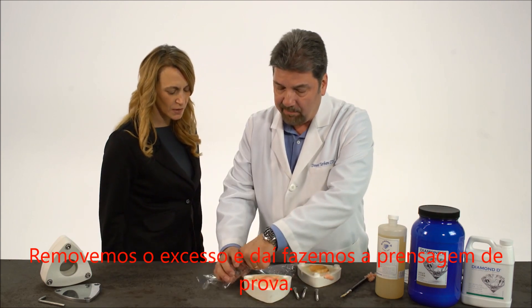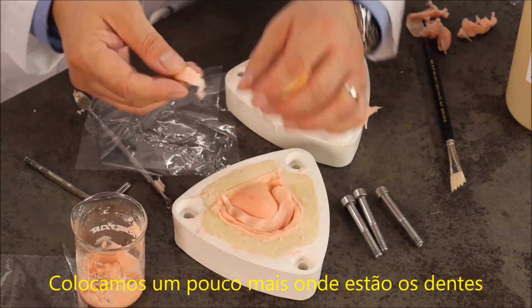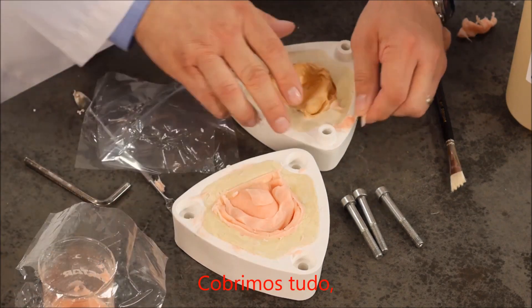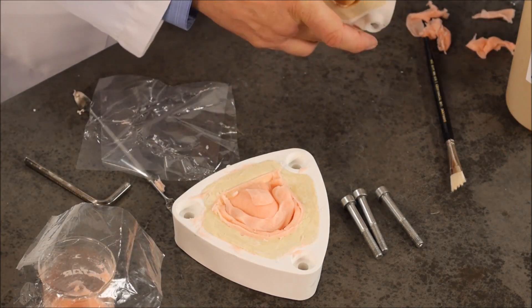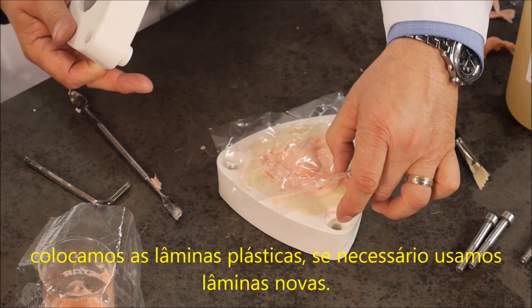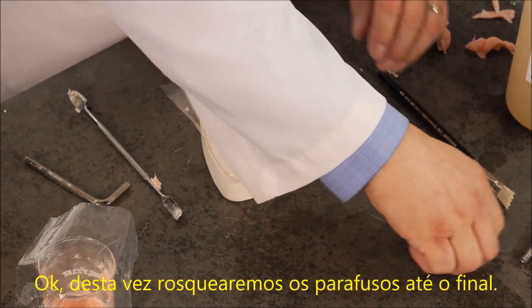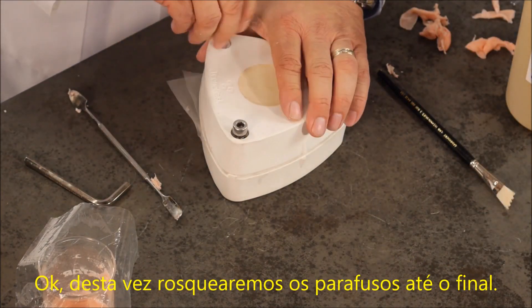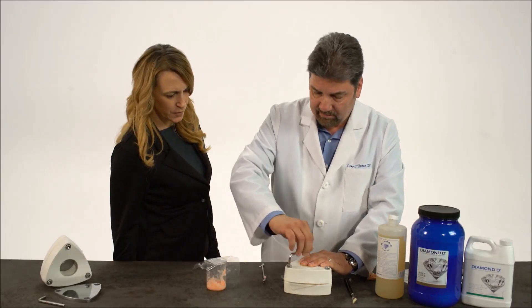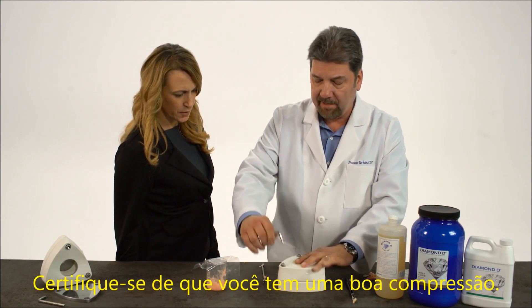Take our excess off, and now we're going to trial pack it. Put it around where the teeth are, and a little bit more on the palate area. Cover that up. Match up the notches on the back. Take your plastic sheets — if necessary, you can use fresh plastic sheets. This time I'm going to tighten it down all the way, very slowly. Make sure you have good compression.